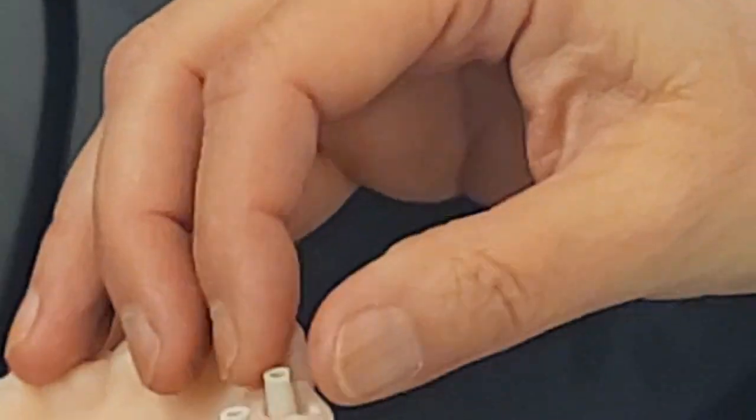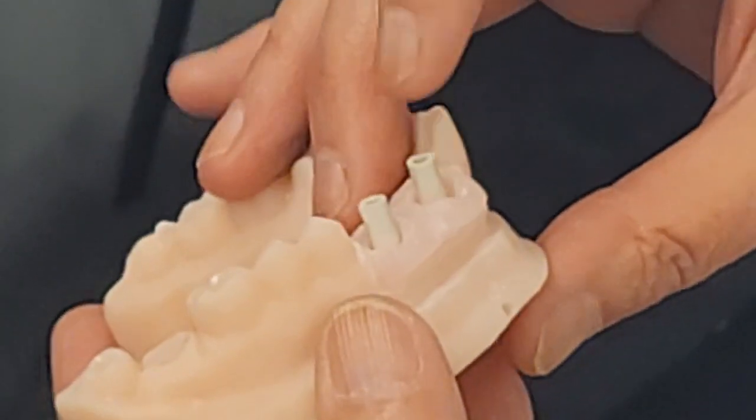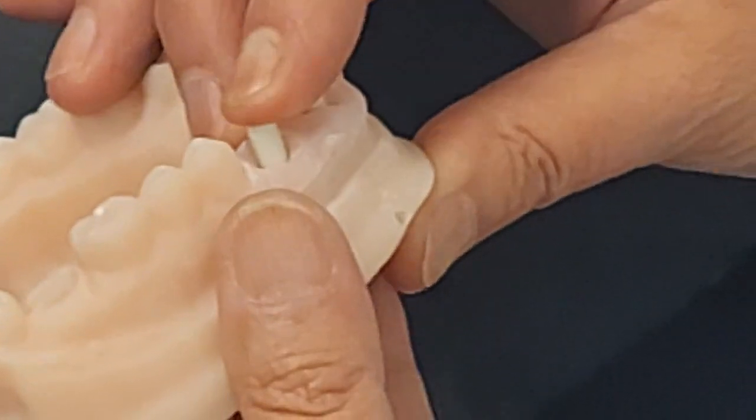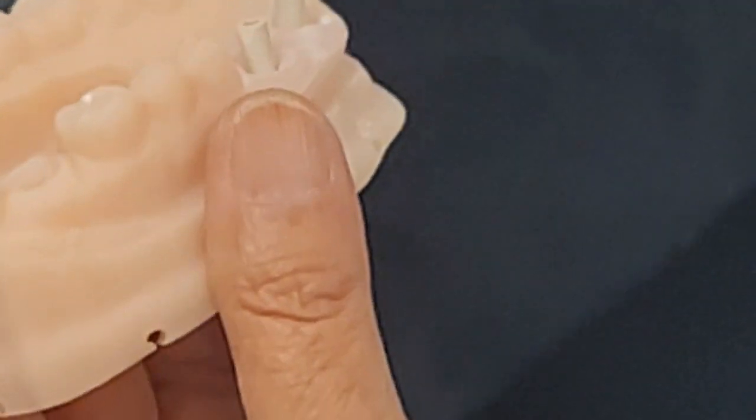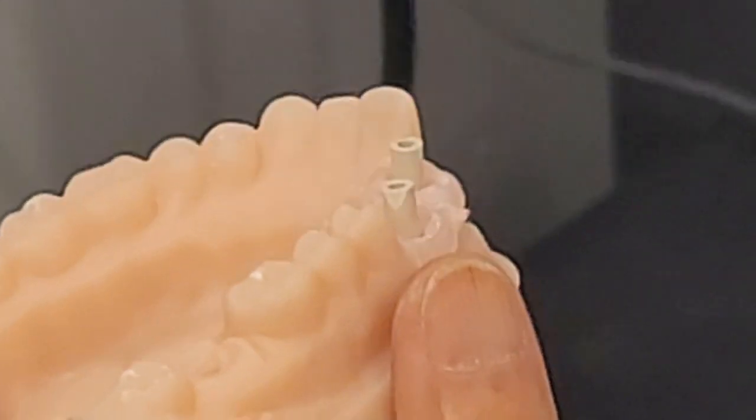And also very important, press on it until you feel it's all the way down. Now, the screws that you use for the tie base are the same screws, so you can screw it in, okay?